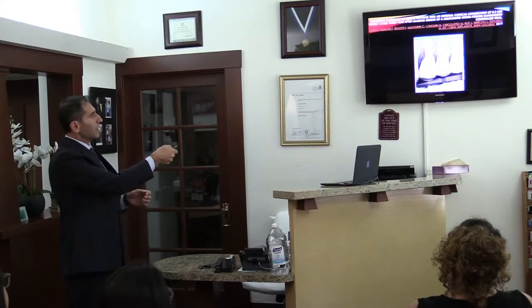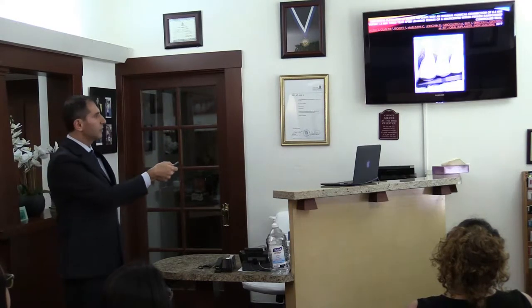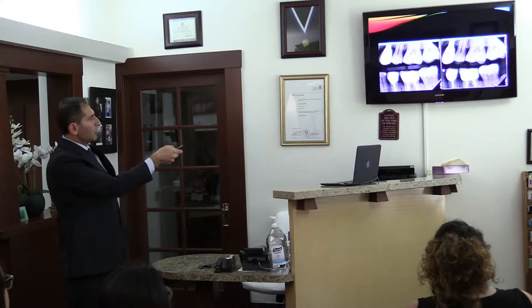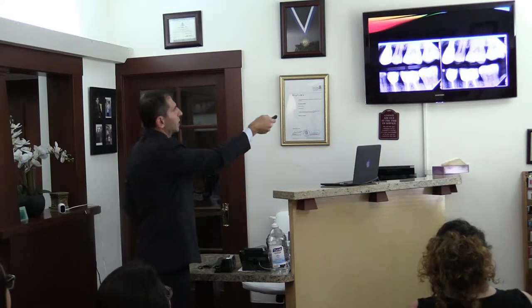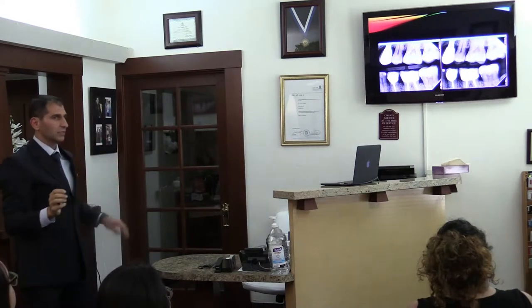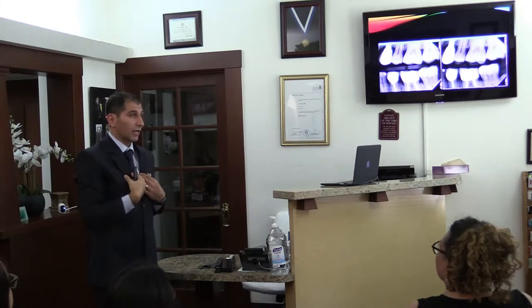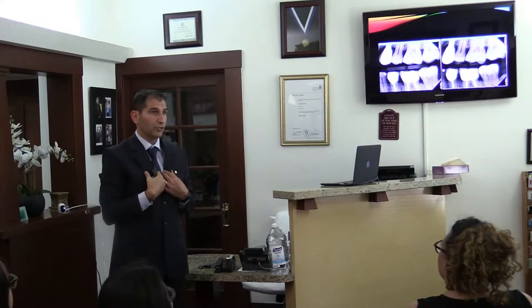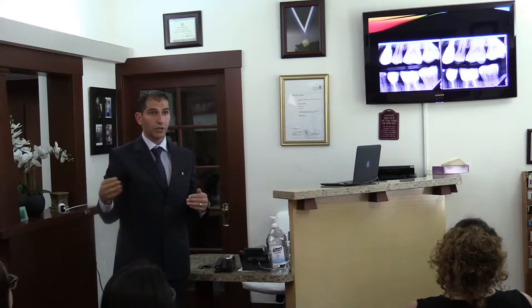So this is my patient Maria, and I did one abutment one time, with immediate placement. I'll share the complete case with you at the end of today. But you can see the follow-up, you can see the bone. This is the bone at abutment level, 2017, 2018. We just saw her in 2018. Nice result on the bone, right? I hope you like it. I was worried doing this in 2016, because I wasn't sure how much evidence I had. If I'm placing it bone level facially, automatically it's going to be subcrestal on the interproximals, right?